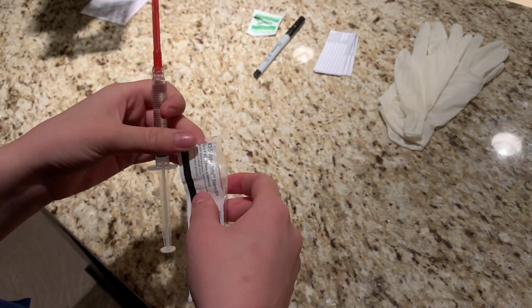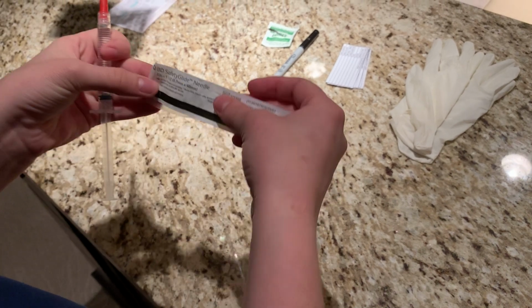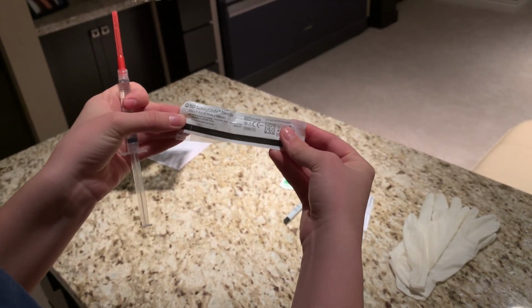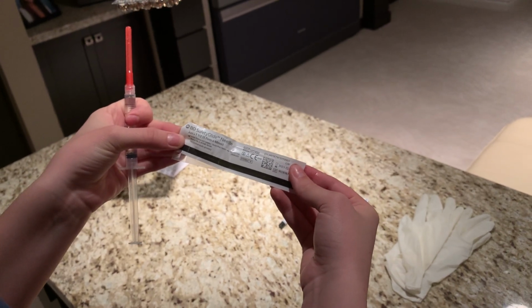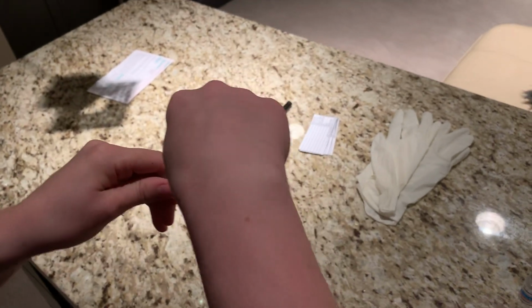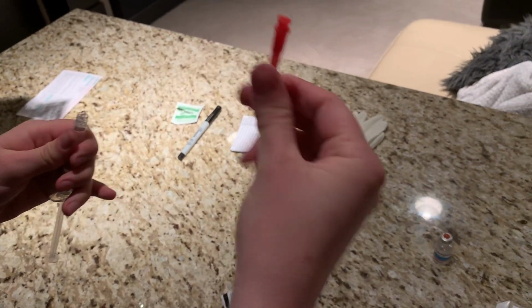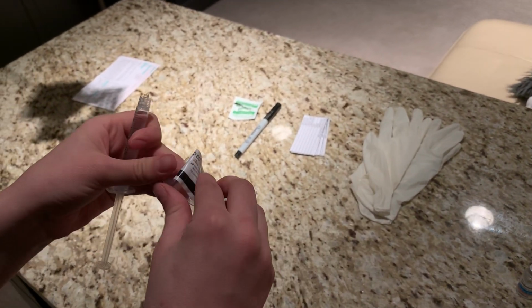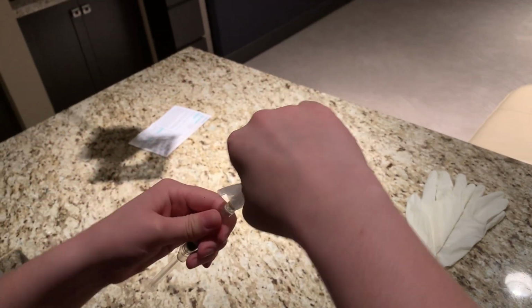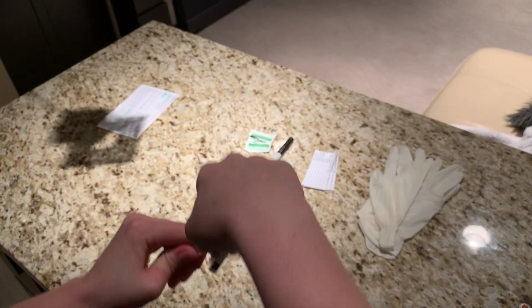And then I can select my insertion needle, which I've chosen a 22 gauge times 1.5 because I've chosen the ventrogluteal intramuscular injection site. So I can switch these out. This would go in the sharps container. And I'll attach the needle.